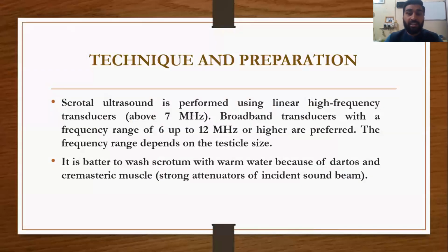Well, here comes the technique and the preparation. Scrotal ultrasound is performed using a linear high-frequency transducer above 7 megahertz. A broadband transducer with a frequency range of 6 up to 12 megahertz or higher is preferred. The frequency range depends on the testicle size.